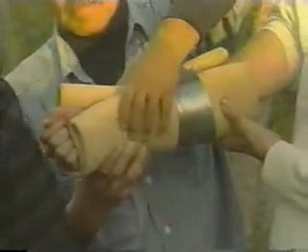A closed cell or ensolite foam pad, often used as a sleeping pad, can also be used in splinting. Wrap it around an injured knee or ankle to stabilize a sprain and secure it with duct tape. Even if you sleep on a self-inflating mattress, carry a small amount of closed cell foam to be used as a splint.